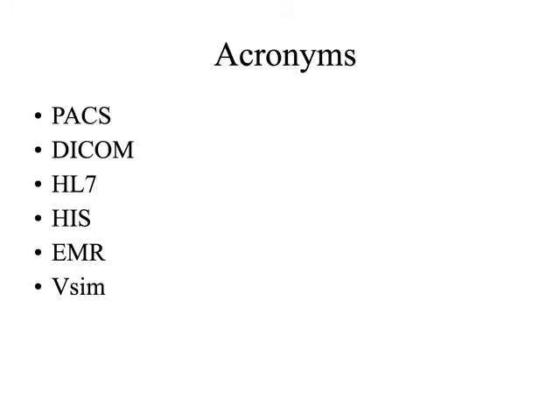And interestingly enough, ARIA is just the tip of the iceberg on it. Because ARIA is actually more like a RIS. Right? RIS is like radiologic information system. ARIA is a special RIS for therapy because we have some special charting that we need to do in therapy that's different from the charting that we do in x-ray or ultrasound, that's different from the charting that they do as nurses.